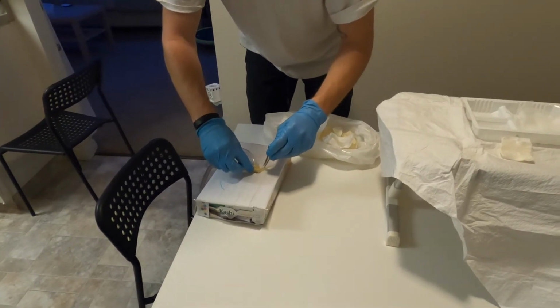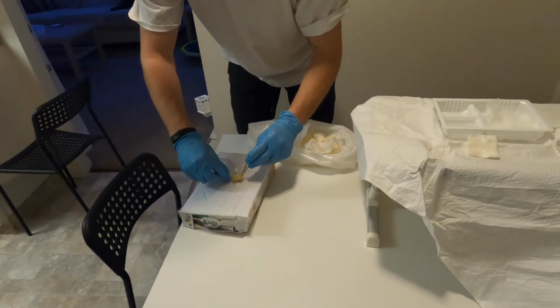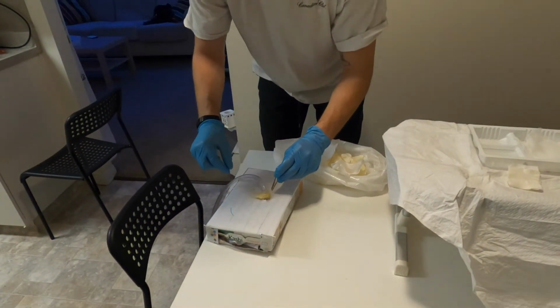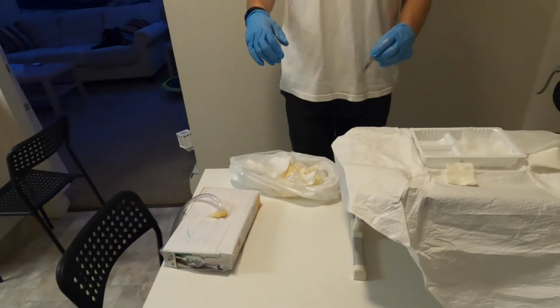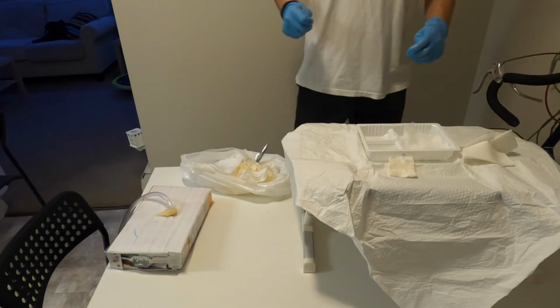Okay. So now I'm going to make sure that the Gelinet sits flush with the chest tube and the peri-wound there, just to seal off that opening there. So now I can discard these.